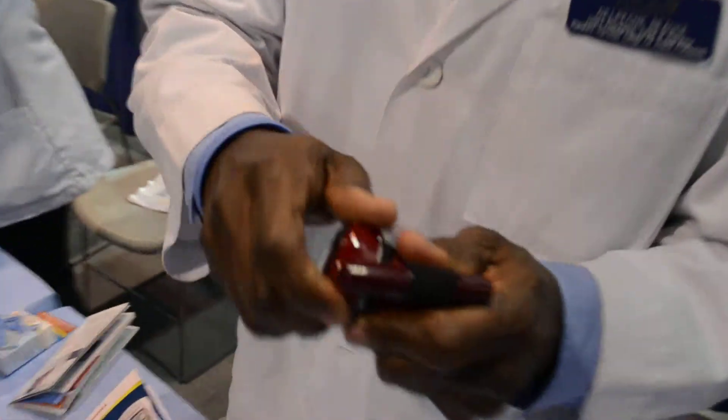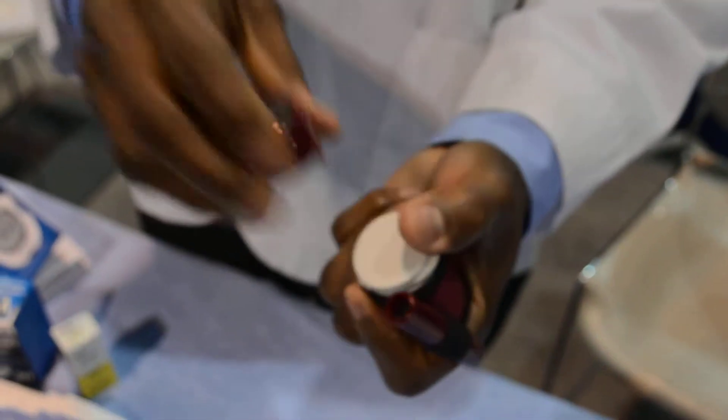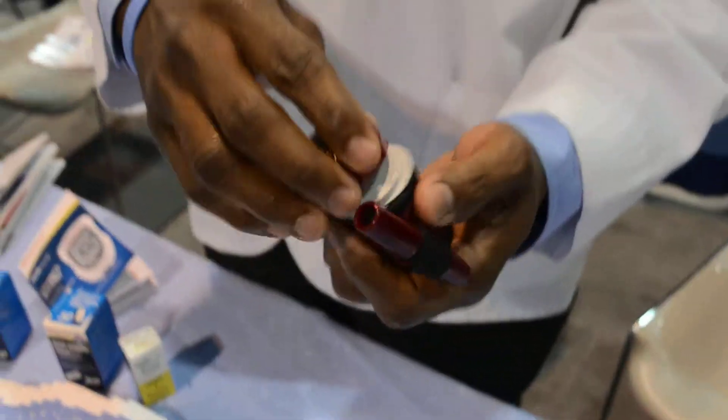It comes with the lancets right here and then the test strips inside. And you have your measuring machine on top, which is pretty cool. It comes in three different colors: purple, red, and blue.